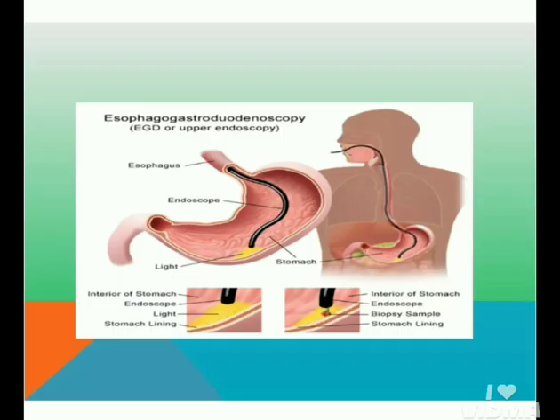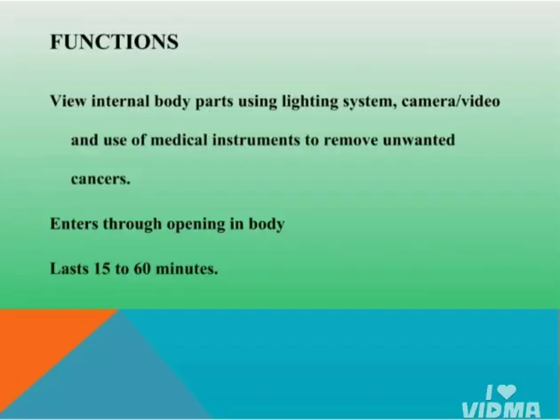Functions: view internal body parts using a lighting system, camera, and video, and use of medical instruments to remove unwanted growths such as cancers, entered through an opening in the body. The procedure lasts 15 to 60 minutes.